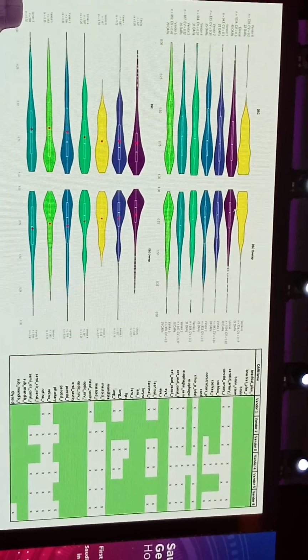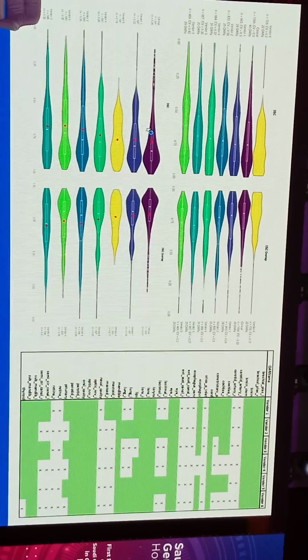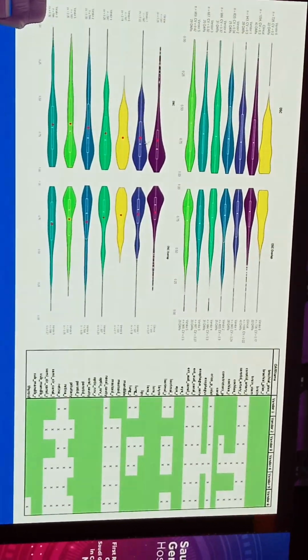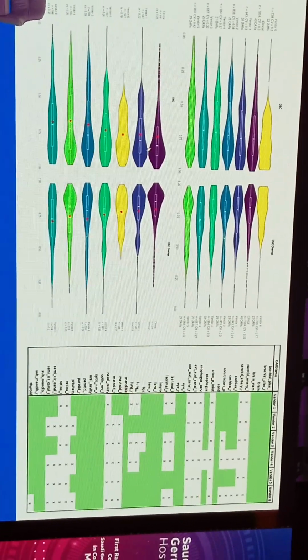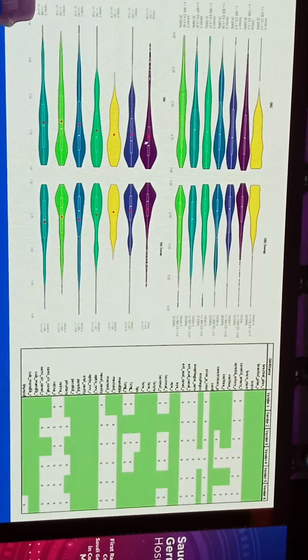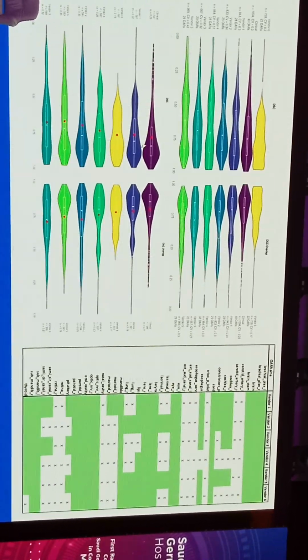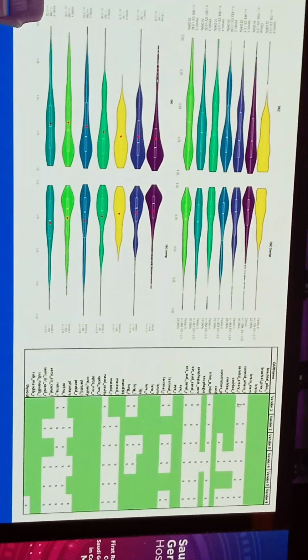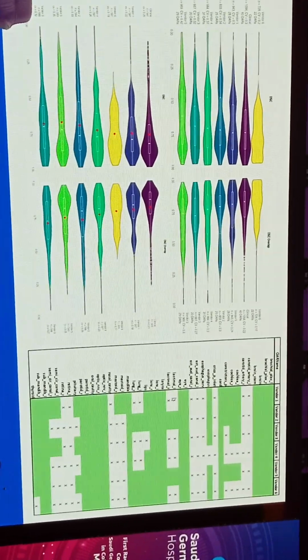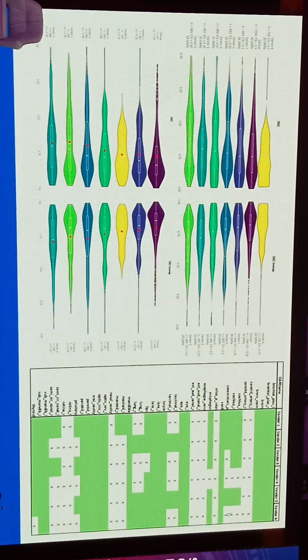And that was especially true if we only looked at the vendors that had overlap in the most common structures, where clinical contours still won out and had the highest median, but vendor 1 and vendor 6 were not statistically different and likely acceptable. Nevertheless, you can see in the X's here that they did not do many structures that we would commonly want, like the cochlea.